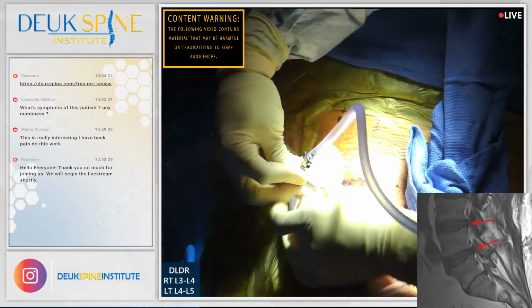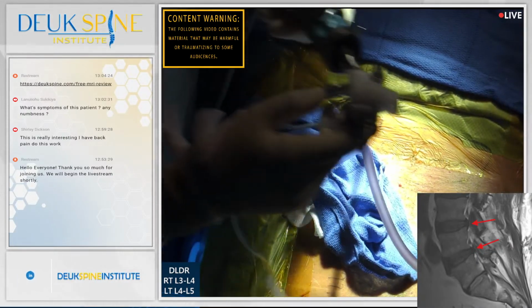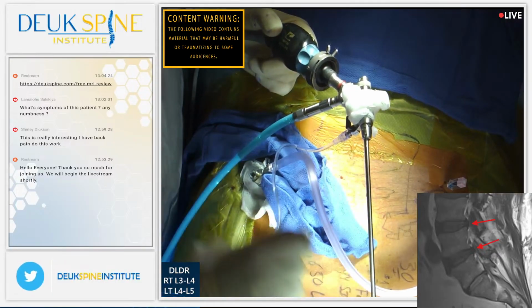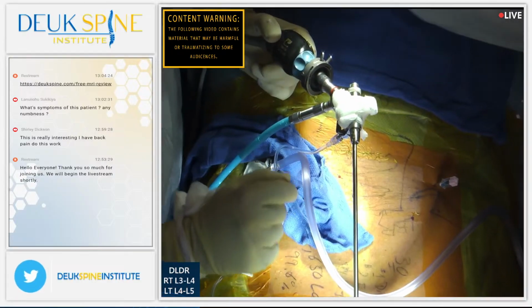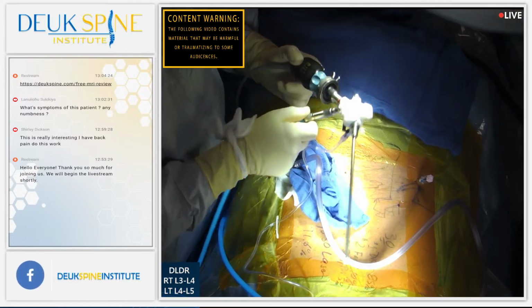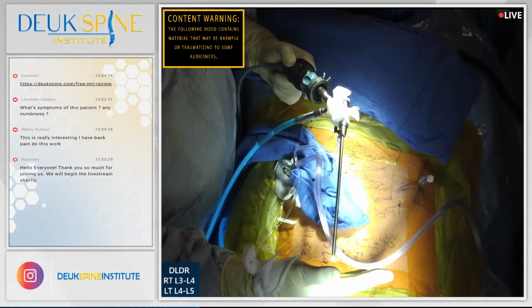Any questions? Yes, this next question is coming from Lanu on YouTube. Before we do that, let me show you guys the endoscope and the entire rig. We've been using the same rig for 20 years. It has a rigid endoscopic shaft through which we can put surgical instruments like the laser or grabbers such as pituitary rongeur. We have a light source at the end. The actual light source is here, and it uses fiber optics to push light all the way through to the end so we can see what we're doing.